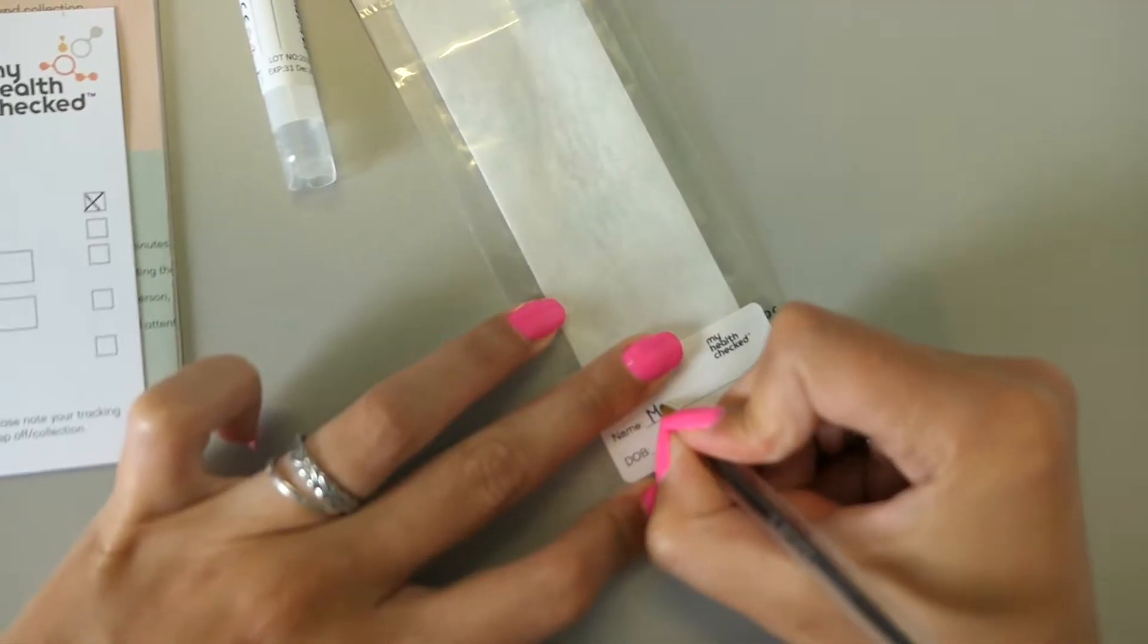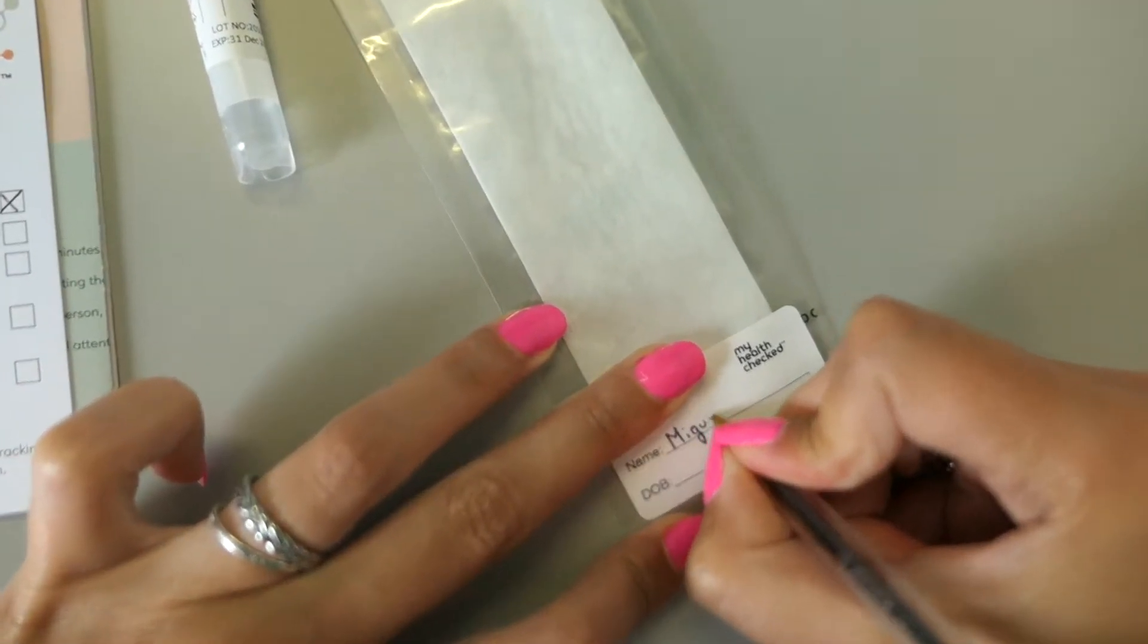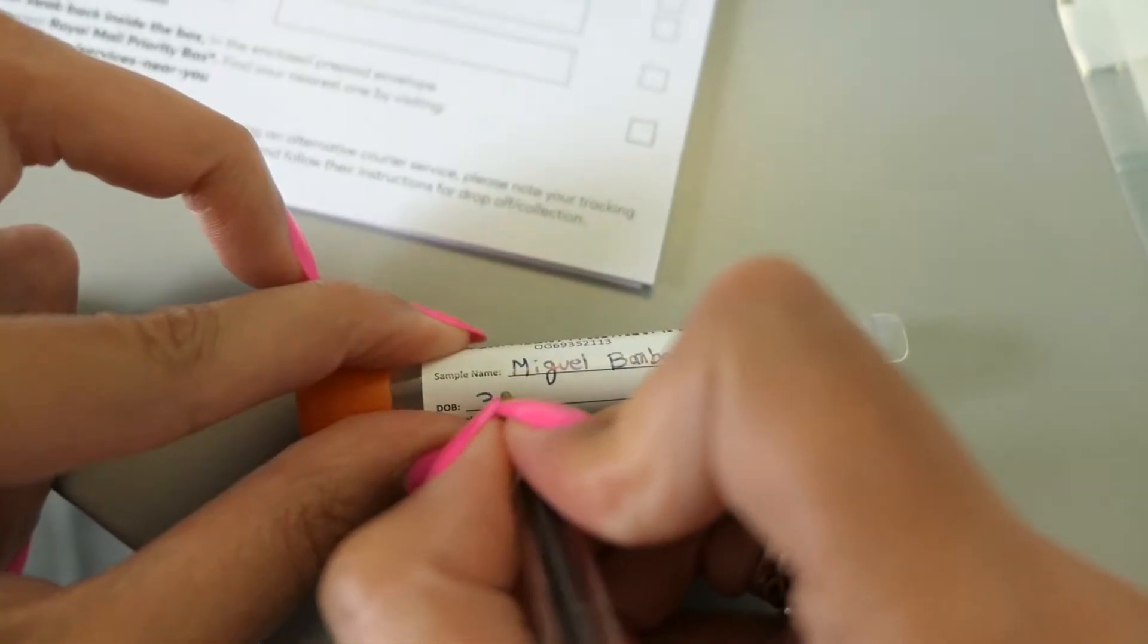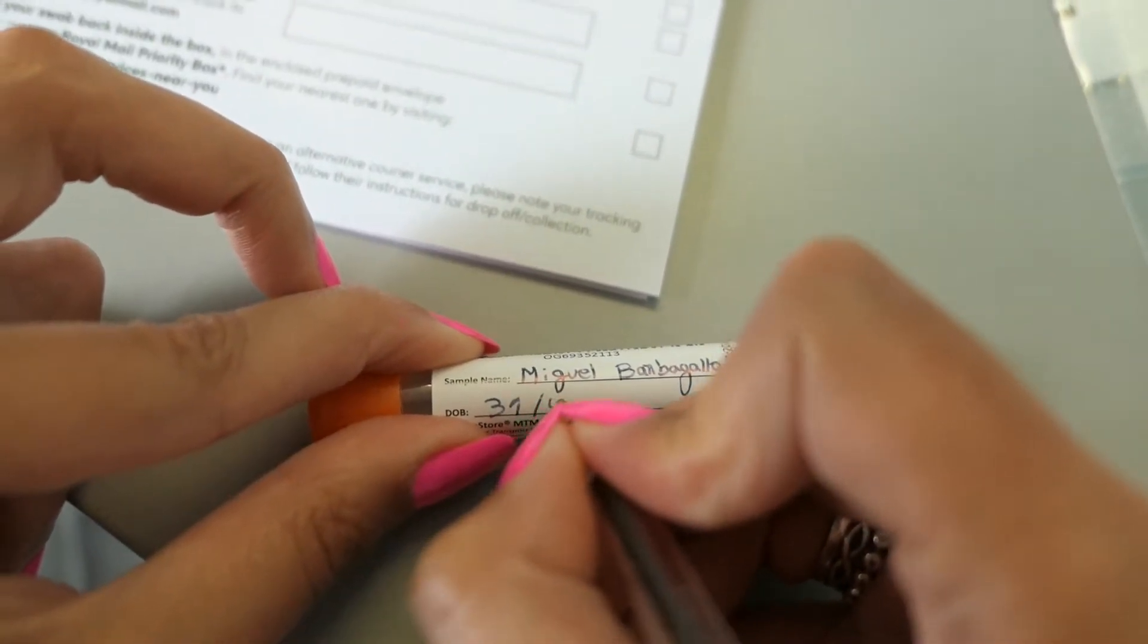You should then complete your name and date of birth on the biohazard pouch and tube of Primestore MTM inactivation media. Obviously, this should match the details registered online in the previous step.